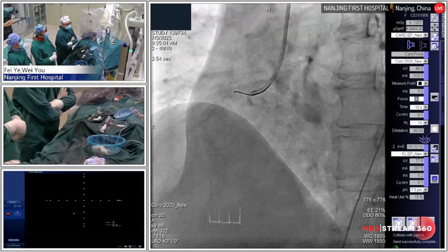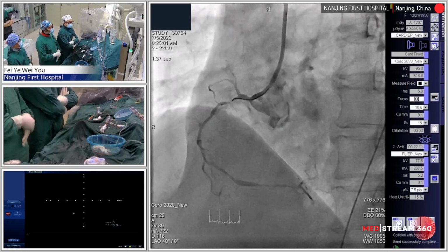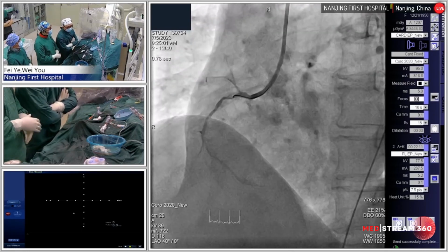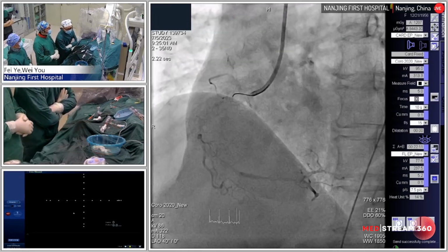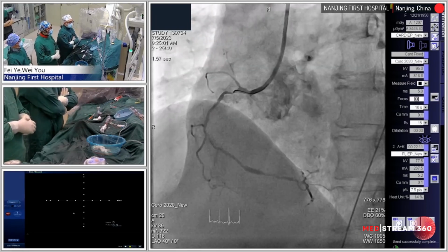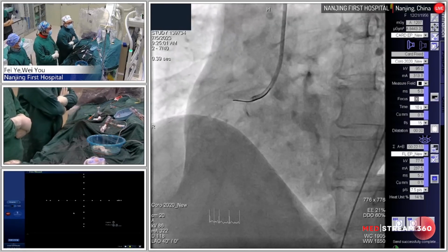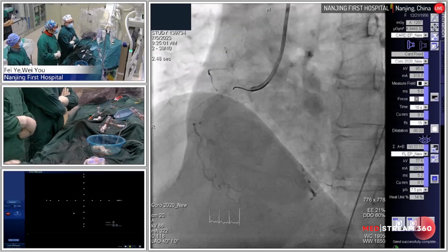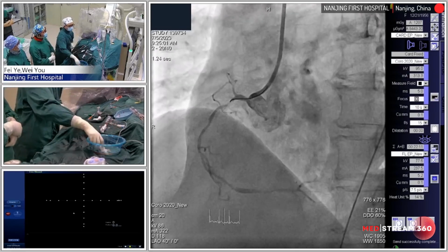although it's a bilateral coronary occlusion, you can see from today's angiography that the right coronary flow is not good, and you can see comparable flow from both sides, because from the posterolateral branch you can see the contralateral flow from the circumflex to the PLA.